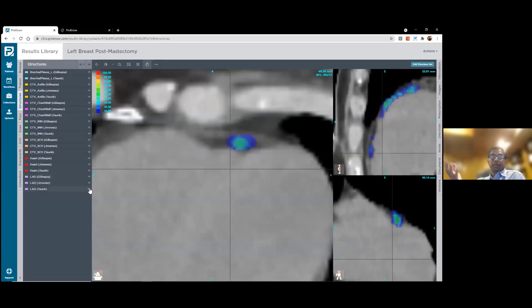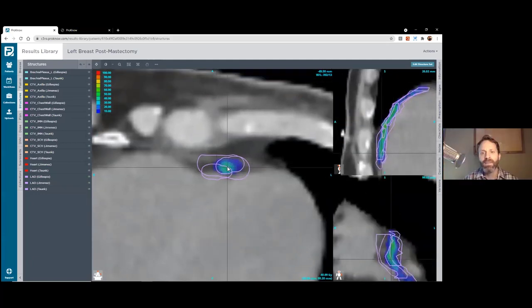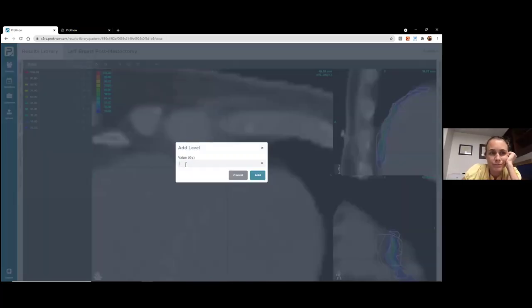I'm very impressed by the fact that most of them contoured the area of the LAD. The volume is variable because of whether they contoured just the vessel or a larger space, but the dosimetric impact of this variation is very minimal — as long as you avoid that area in breast cancer, you've done the job. So even though there is large variation in absolute volume, location-wise and position-wise there is significant consistency in the contouring. Well, let me break in there — this is blue and yellow, which means there's very little consistency. We see a cloud of stuff but nowhere is it red, orange, or even yellow at peak.